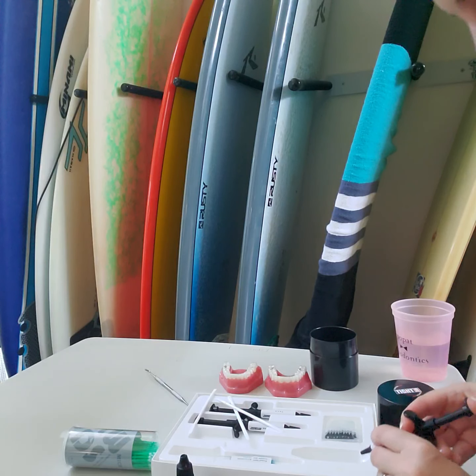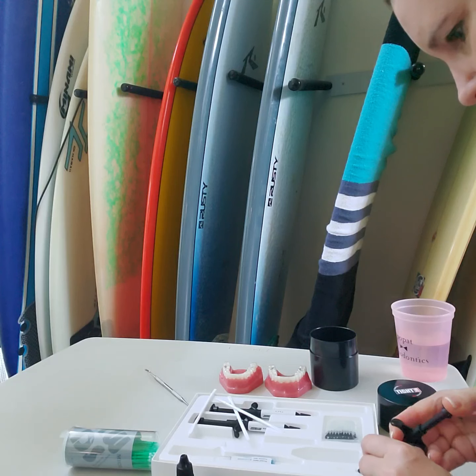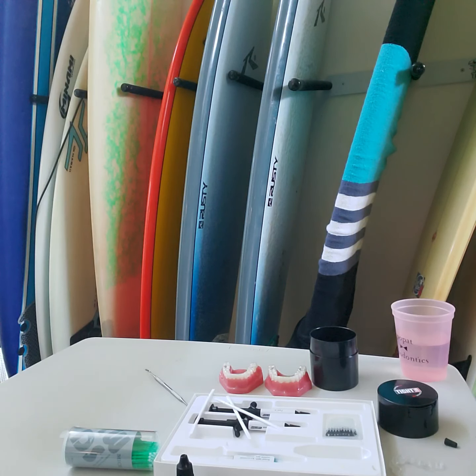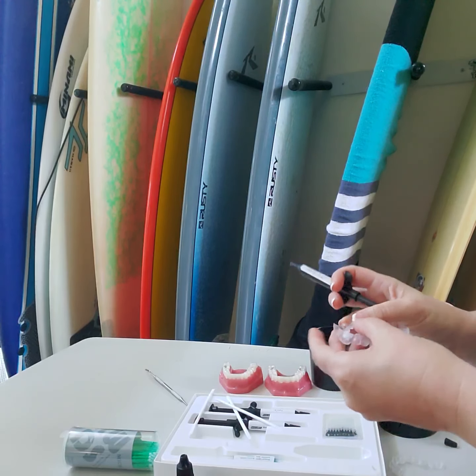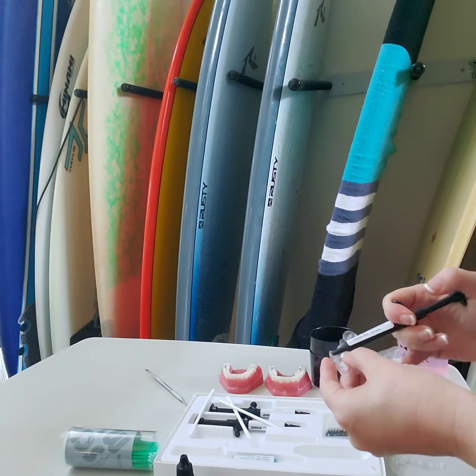Take a little bit of this. You can do it. Ooh, this one is pretty thick stuff. Always express the first part out first because it might be kind of hard. Okay, I'm just going to go ahead and fill it. Fill it nice and fast, and then you'll pat it down and get the excess off.